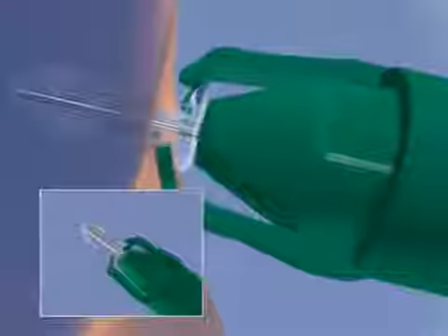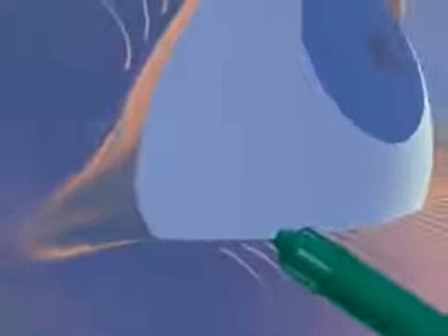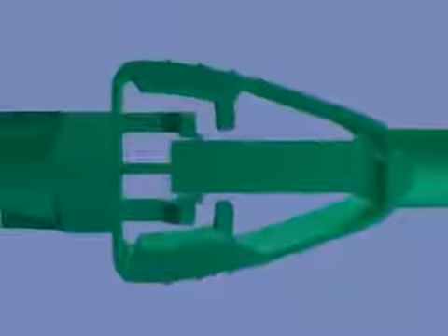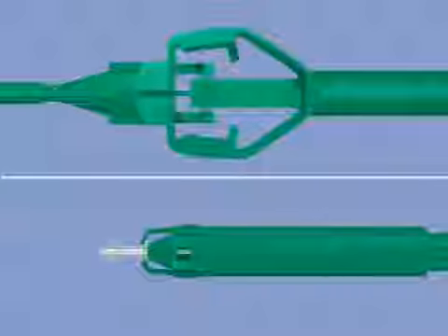At the same time, the needle pulls back and out of the plug to allow the plug inserter to be withdrawn. Note that it is very important to ensure that the arms of the fingertip controller touch the body of the plug inserter. Full actuation is required to release the plug and leave it in position in the punctum when the plug inserter is withdrawn.